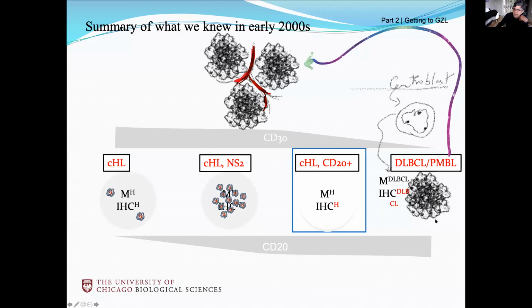And then they started describing cases of primary mediastinal large B-cell lymphomas that seemingly arise from thymic asteroid B cells. And strangely, when you biopsy them, they would have this kind of compartmentalizing sclerosis and nests of tumor cells in the compartmentalized areas. So that kind of was an interesting thing, but how does all of this relate to the realm of Hodgkin lymphoma? So that's the next question. So to explain that, let's see a case.